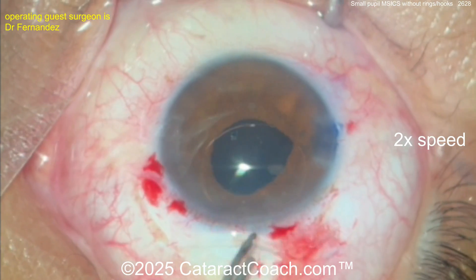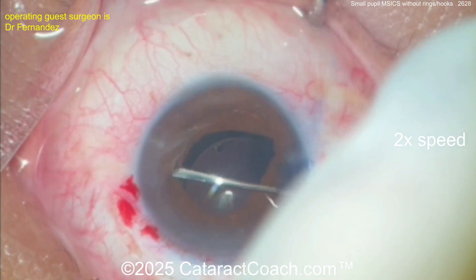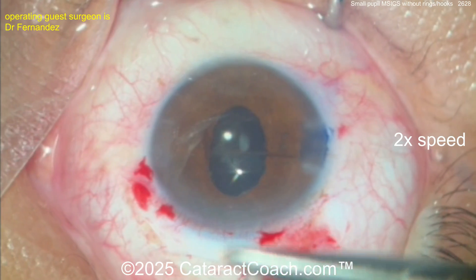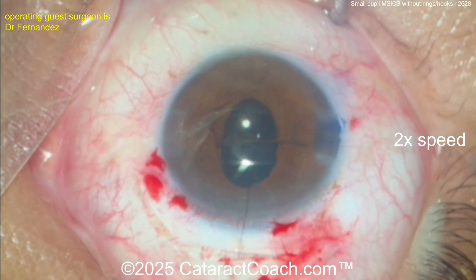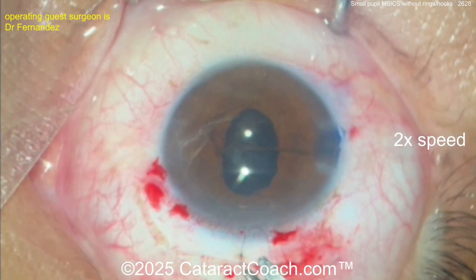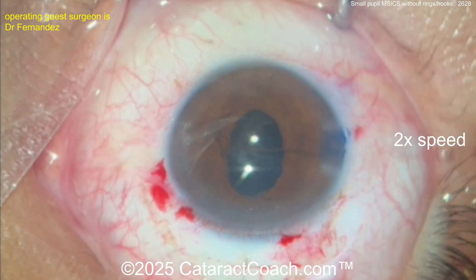There's the viscoelastic going inside the eye and we're going to put a lens in. It looks like a PMMA lens — polymethylmethacrylate, a non-foldable lens — and that goes in. Make sure it's in the capsular bag. Here's where I like to lift up the iris 360 degrees. The surgeon is putting a suture in — I agree. I do MSICS a couple of times a month and I like to put a couple of sutures in just to be sure; it helps me sleep better at night knowing that even if the patient rubs the eye we're going to be fine.